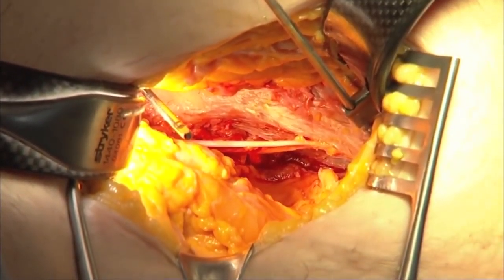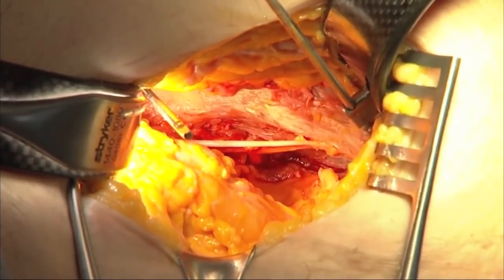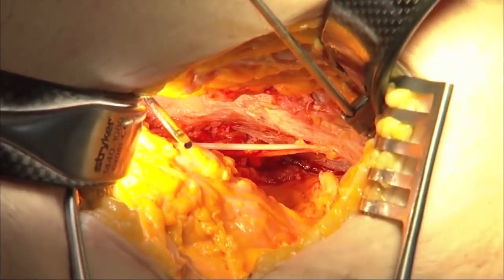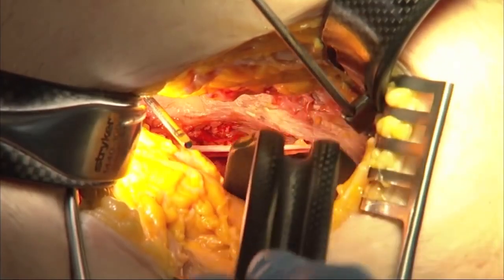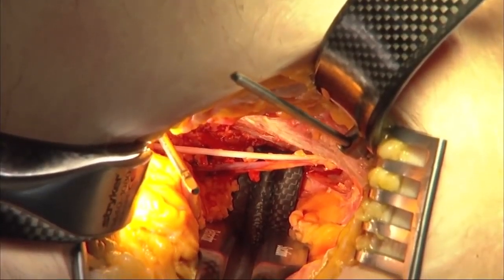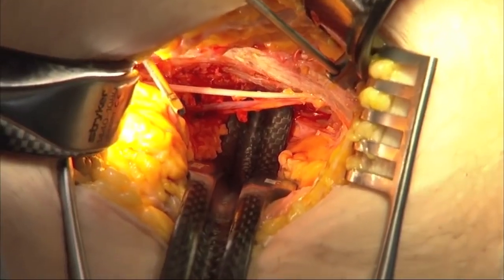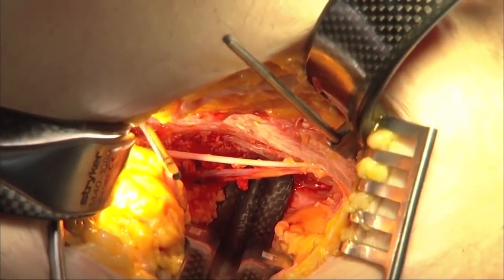The other structure that often gets in the way with this exposure of the posterior column and the quadrilateral surface is the bladder right here. And so the next retractor that Mike showed you, which goes into the base of the wound, and the suction retractor, is also designed to help push the pelvic viscera out of the way to improve the exposure of the posterior column and the quadrilateral surface. You can see how the retractor hinges into the greater sciatic notch.